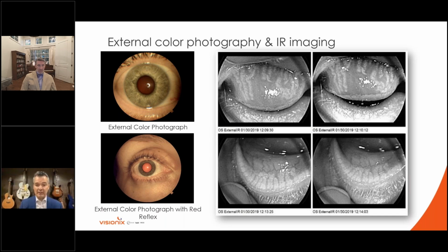Why this is important is we all know that a contact lens wearer, and especially a scleral lens wearer, doesn't live in isolation of just simply a cornea that we're fitting. It's an ocular surface that we're fitting, and we need to be well up to speed on what's happening with that ocular surface so that we know how to guide that individual. And Jeff, this is one of the tools that we have to identify ocular surface disease and risk for it. How important do you think that is with our specialty lens wearers?